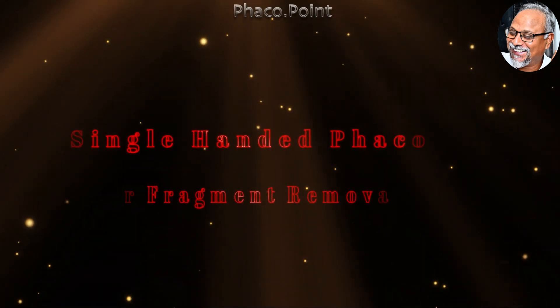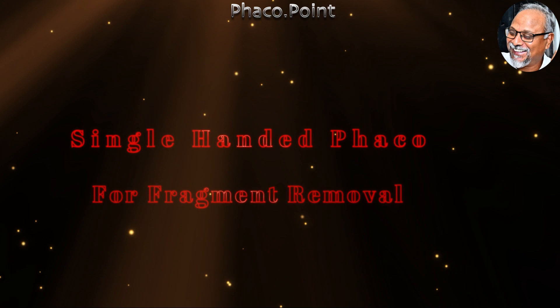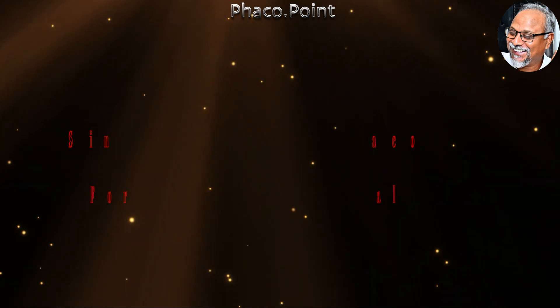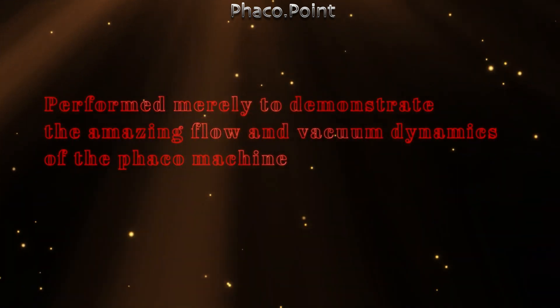Hello friends, today I'll show you how I perform a single-handed FACO for fragment removal. This is not an attempt at daredevilry, nor is this a recommended technique. I'm merely performing this to demonstrate the amazing flow and vacuum dynamics of the FACO machine.